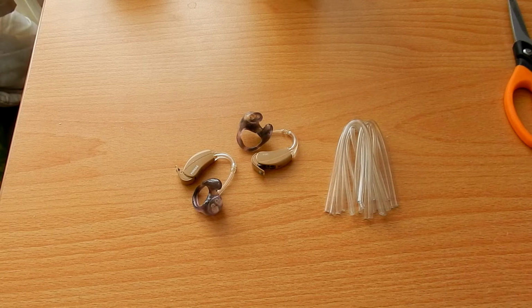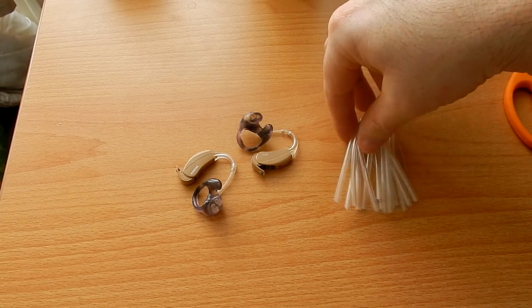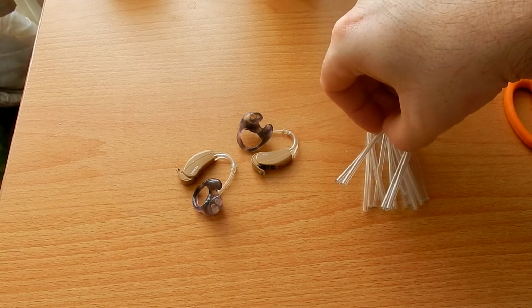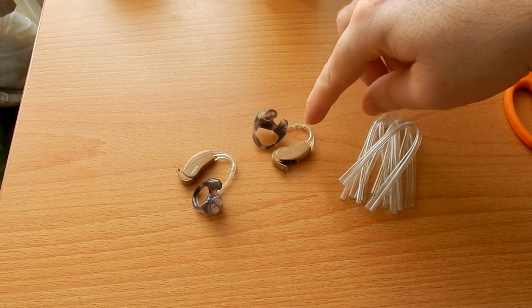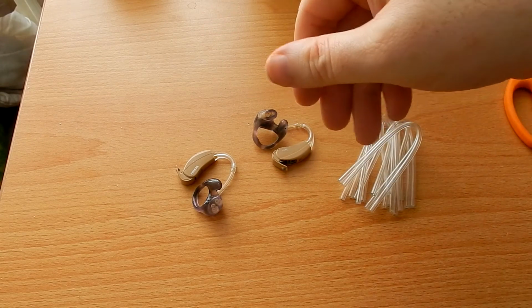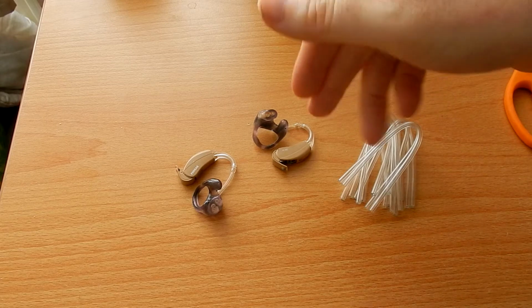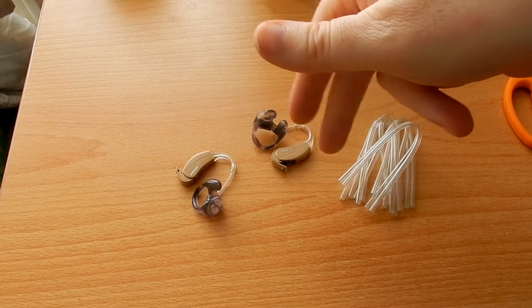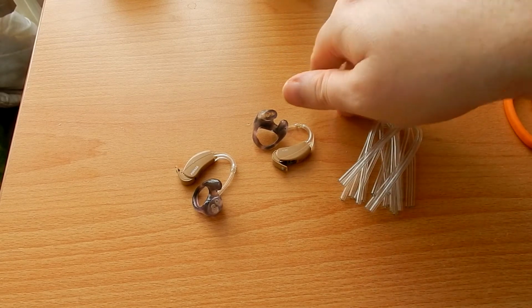Hello, today I'm going to show you how to replace the tubing on a hearing aid, especially if you've got these hearing aid moulds. A lot of hearing aids these days give you a different variety, but I've chosen the skeleton type mould because this is the one I prefer the most.